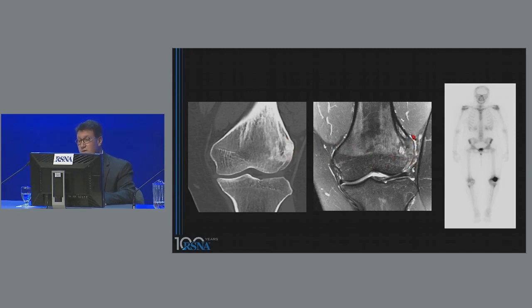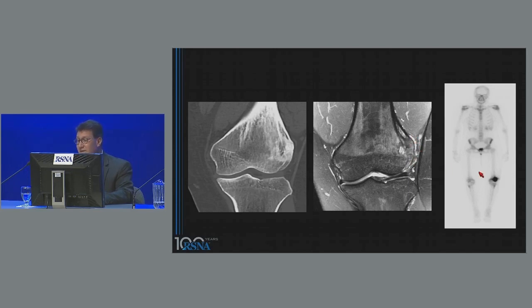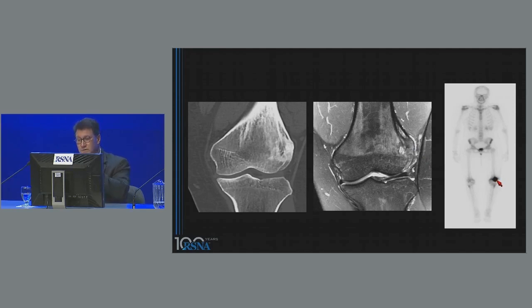And then there's another feature here, which is this little beaded area of high signal intensity. I wasn't sure if that was just a vessel bowed over this lesion, or whether this was actually a little bit of soft tissue extension. And then you have a very hot, intense, large focus of uptake corresponding to this area on the bone scan.